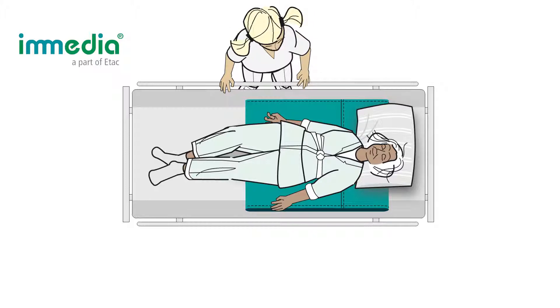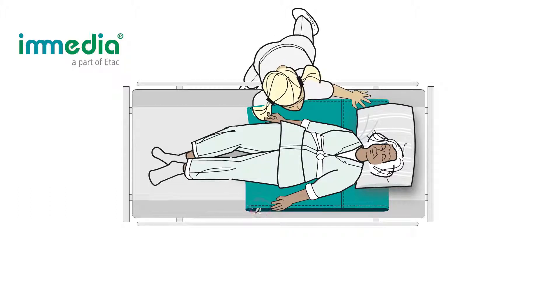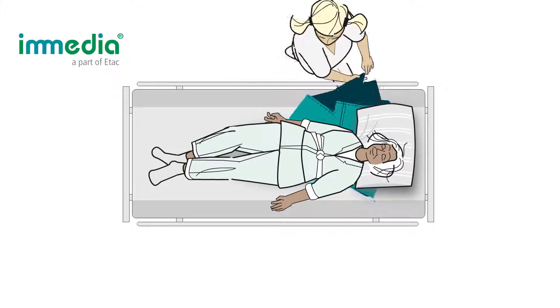Put your hand on the inside of the Multiglide and grasp the opposite corner. Pull the Multiglide out through the tube to turn the fabric inside out.